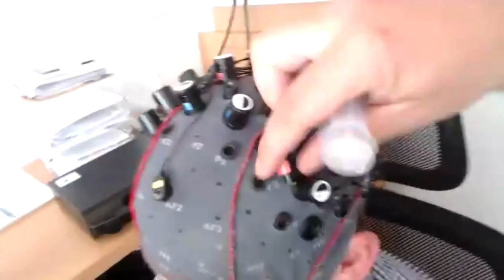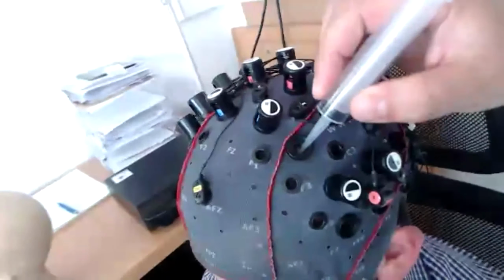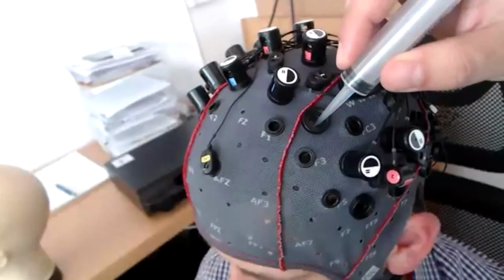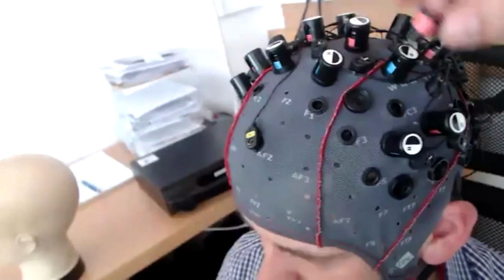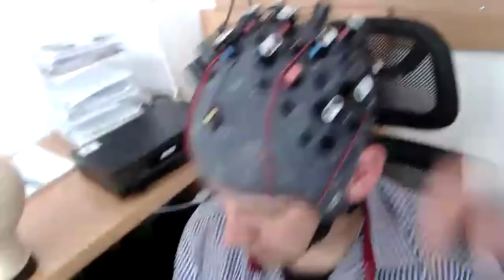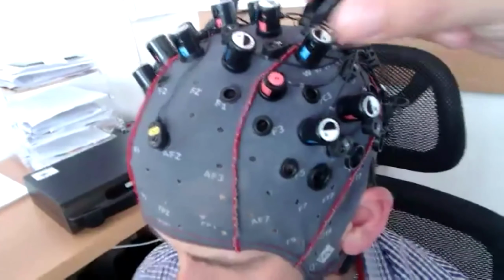So coming back, this is the source. Okay, let me see how I can properly. Okay, that's better. So this is the source. In here we can see that there's a bit of hair, and I'm just removing it, putting it to the side, and place the source in here, and then the holder that has a small spring inside.